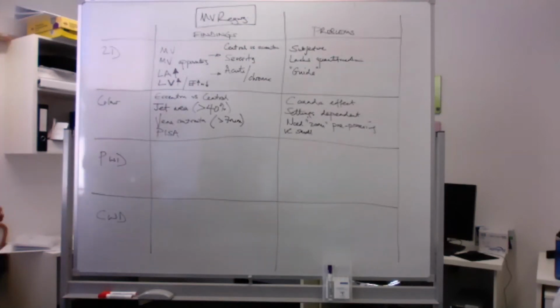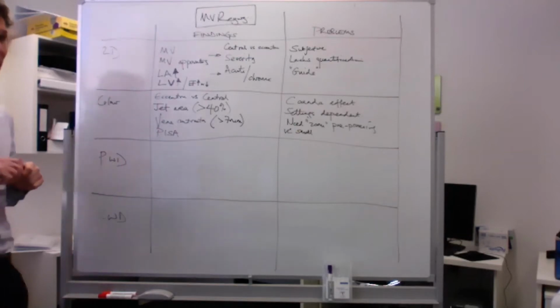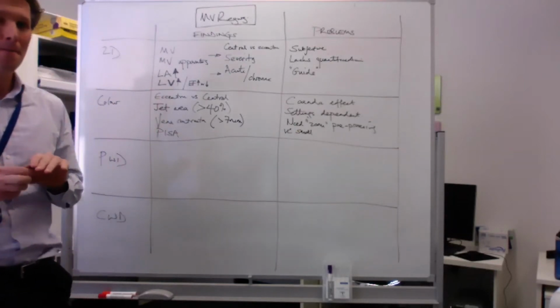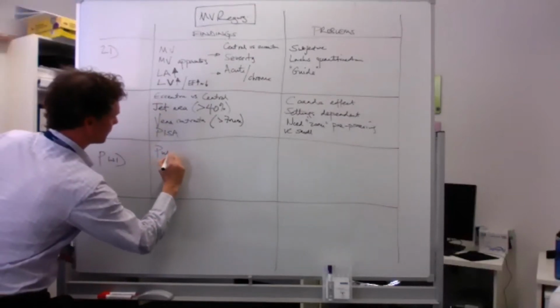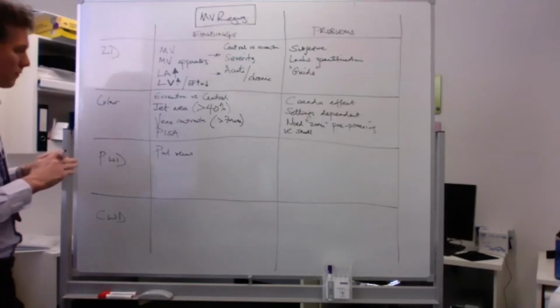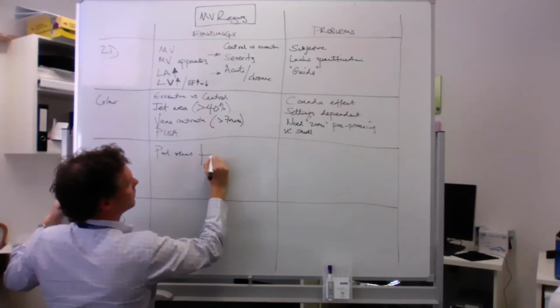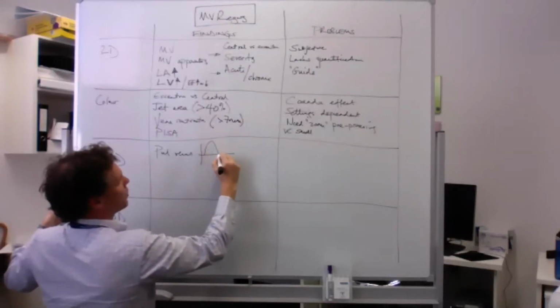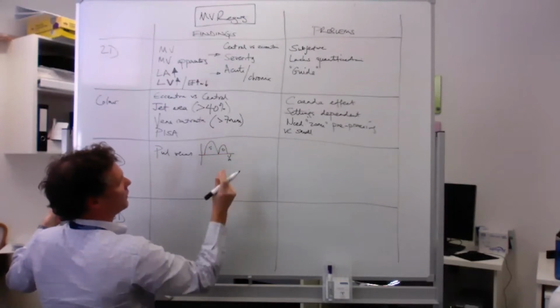Pulse wave Doppler. This is my favorite. The pulmonary Doppler, the pulmonary veins, will give you information about the severity. So normal is S dominant, with D and A reversal. S, D, and A reversal.